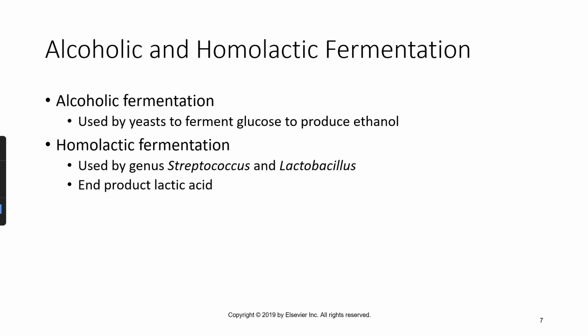Alcoholic fermentation is used by yeast to ferment glucose to produce ethanol. Very few bacteria have the ability to produce alcohol from fermentation. So we don't usually focus a lot on alcoholic fermentation, and our metabolic tests are not designed around the detection of alcohol fermentation.